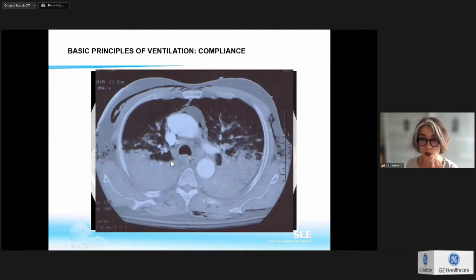So here, what I do see is that actually I have a lot of lung collapse. So it means that the part of the lung which is available for the gas exchanges is only 50% of my lung. So what is happening here, I can't put exactly the same tidal volume, because here, if I put exactly the same tidal volume, each alveoli will receive double the tidal volume than in the previous one. So basically, in adults, it is what we call the baby lung.